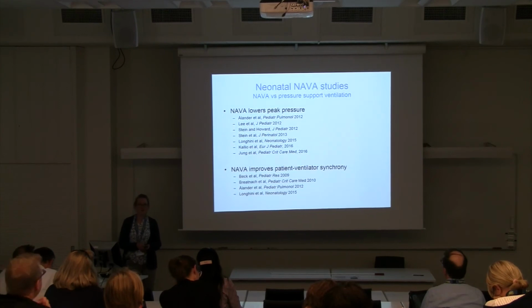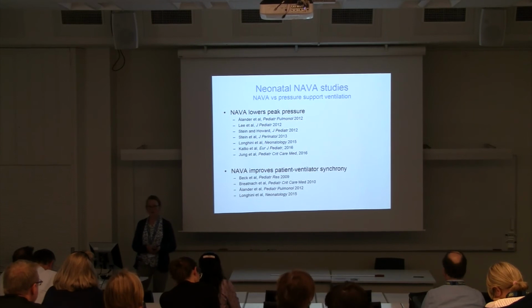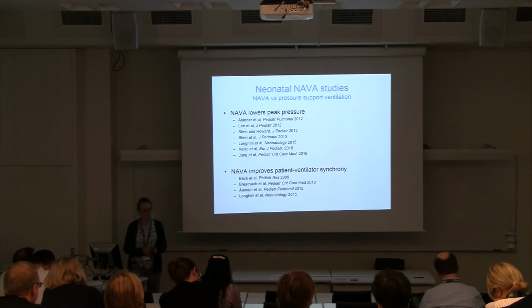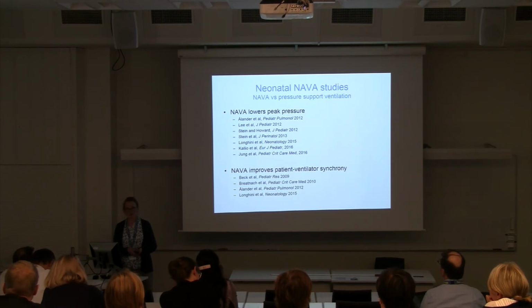So the same decrease in peak pressure has been shown in quite a few neonatal studies already. And also it has been shown that NAVA improves patient-ventilator synchrony.